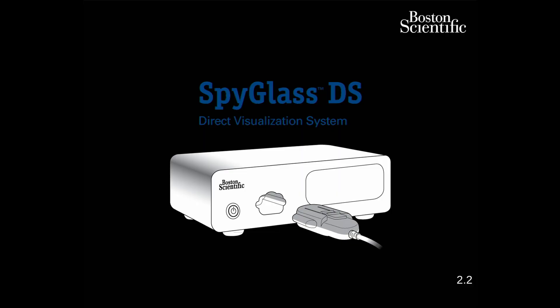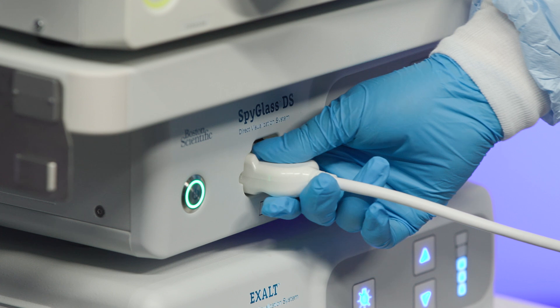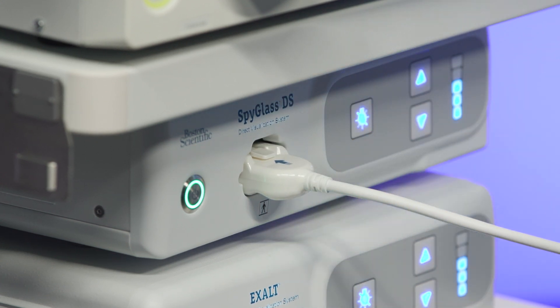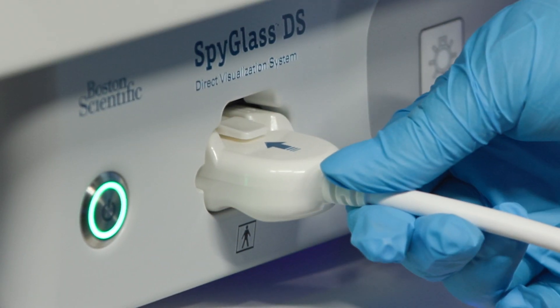When the monitor used with the controller displays the cable connect screen, plug the SPI Scope DS2 catheter cable connector, locking tab facing up, into the receptacle on the front panel of the controller. Push the cable connector in until the locking tab engages.